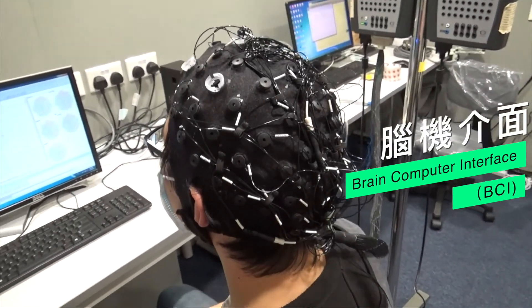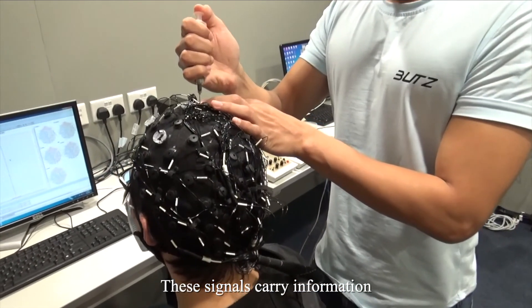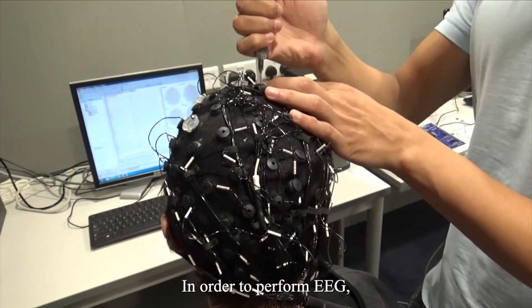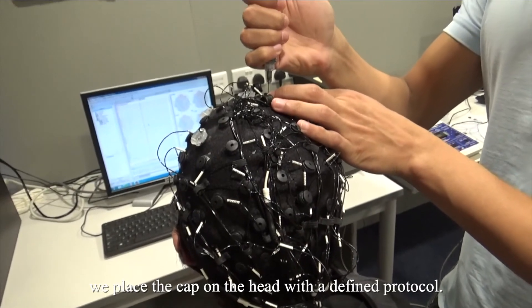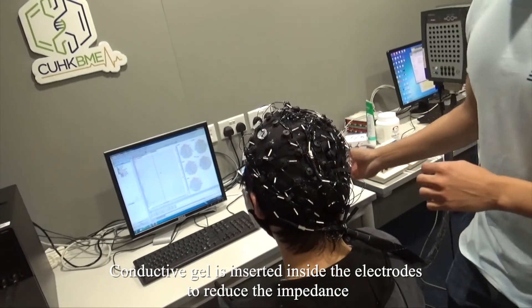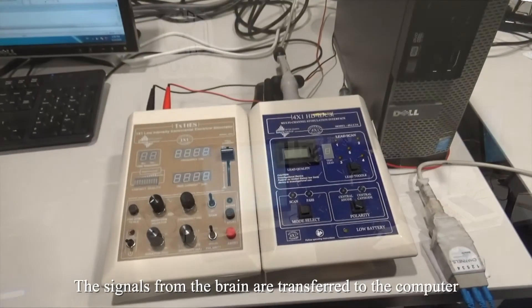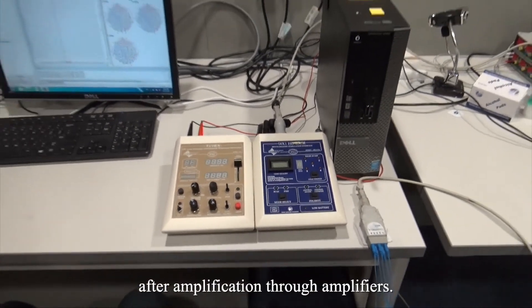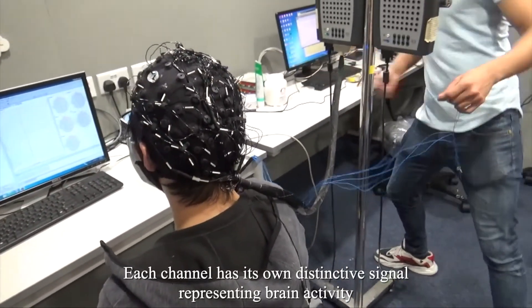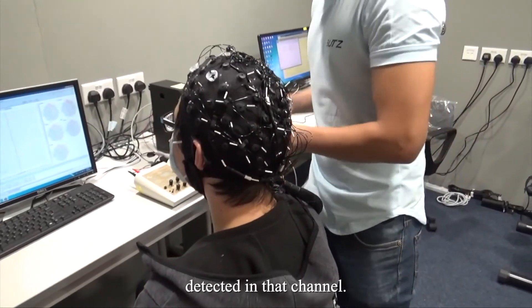Electroencephalography, EEG, is a method to capture electrical signals from the brain. These signals carry information about the processing of the brain. In order to perform EEG, we place the cap on the head with a defined protocol. Conductive gel is inserted inside the electrodes to reduce their impedance and make the contact more conductive. The signals from the brain are transferred to the computer after amplification through amplifiers. Each channel has its own distinctive signal representing brain activity detected in that channel.